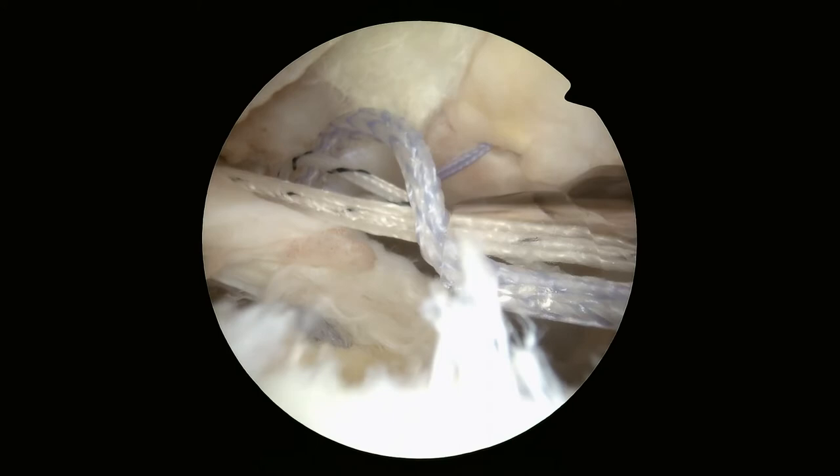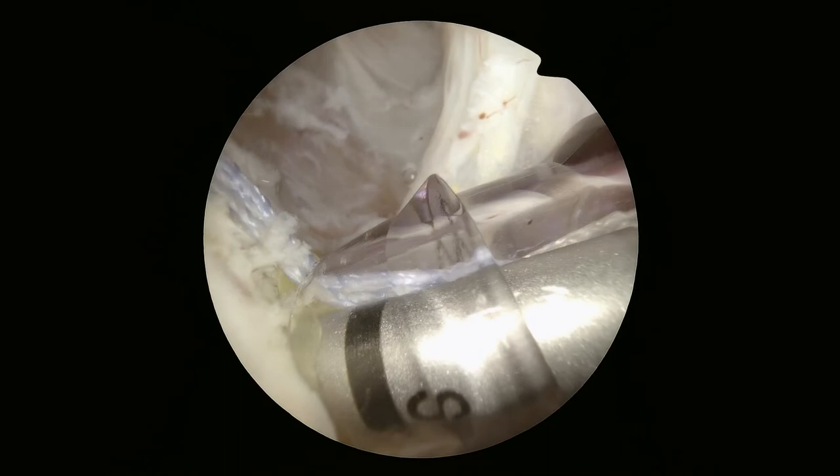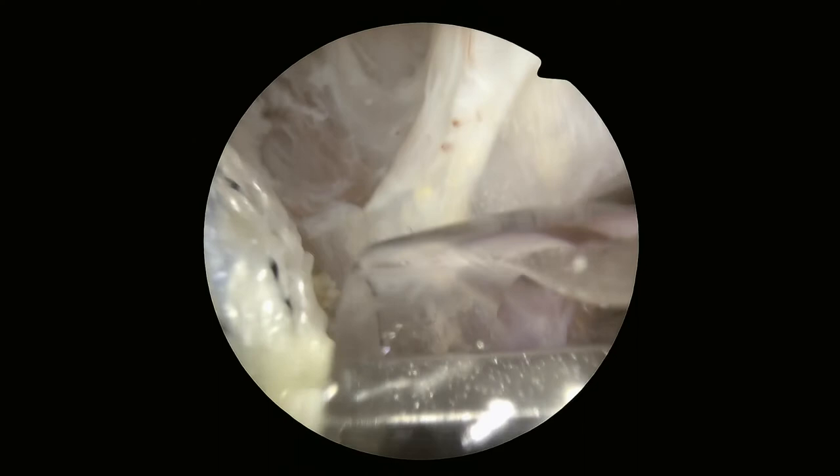We pull them over the top and use another anchor further over. What this does is put the suture on top of the rotator cuff so we can tighten it almost like a zip tie. That pushes the rotator cuff onto the bleeding bed of bone that we created, where the rotator cuff is supposed to attach.